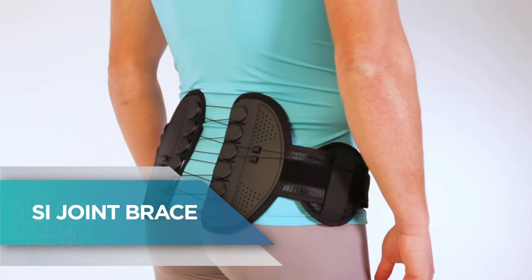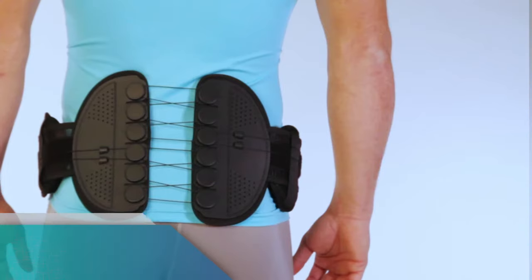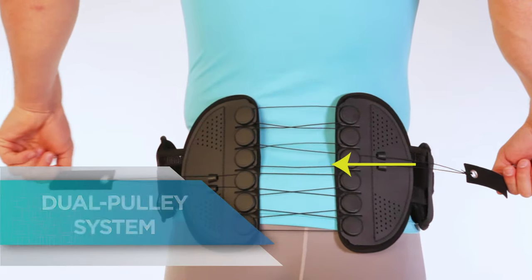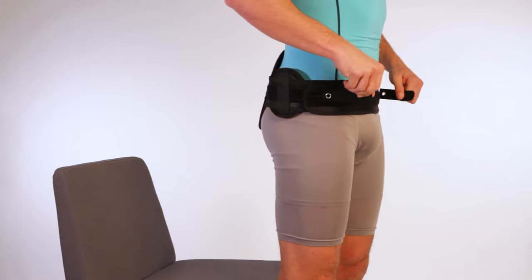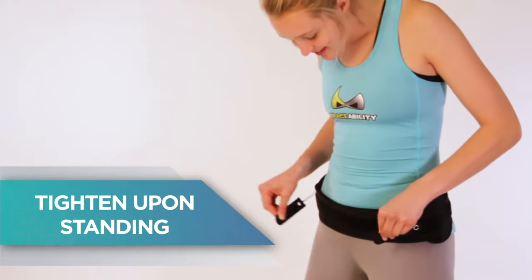SI Joint Brace by Braceability. Perfect for everyday use. Supports your L5 vertebrae to your coccyx bone. The dual pulley system multiplies your force for optimal compression. Loosen when sitting down, and tighten upon standing.